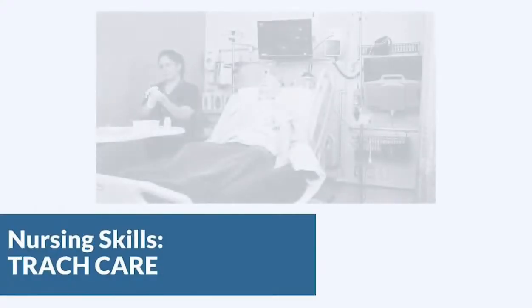In this video, we're going to look at trach care. Remember, you should always suction the patient before trach care. So if you haven't watched that skill video yet, make sure that you watch it.